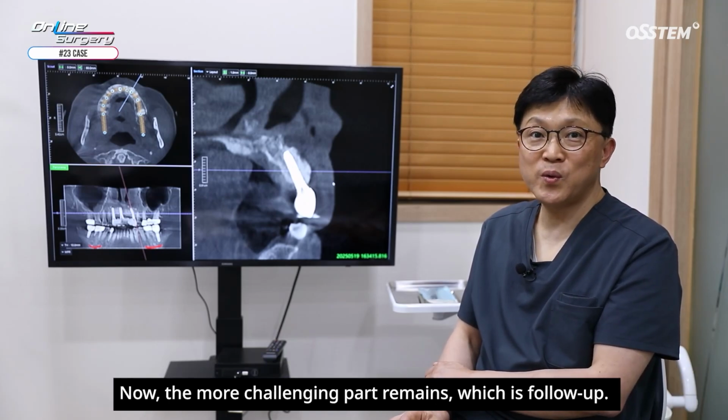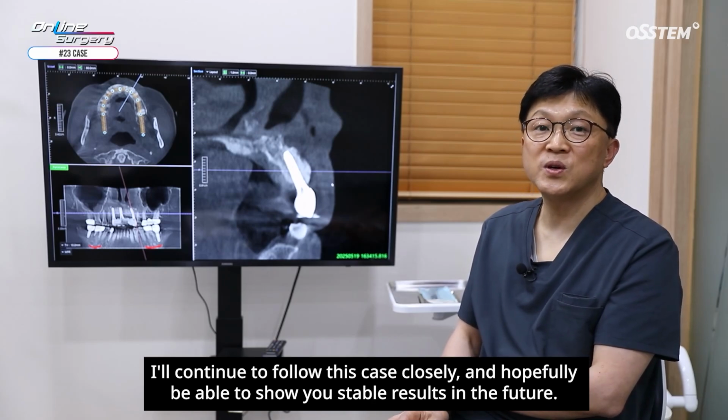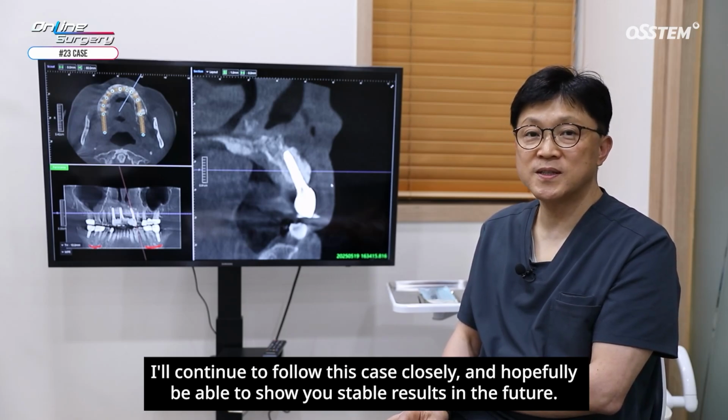Now, the more challenging part remains, which is follow-up. I'll continue to follow this case closely, and hopefully be able to show you stable results in the future.